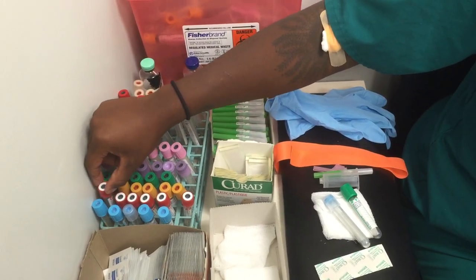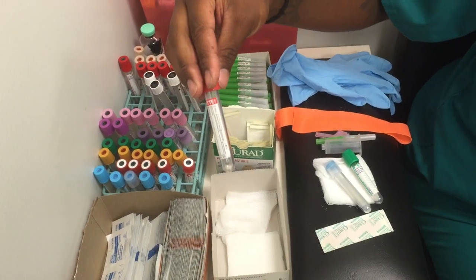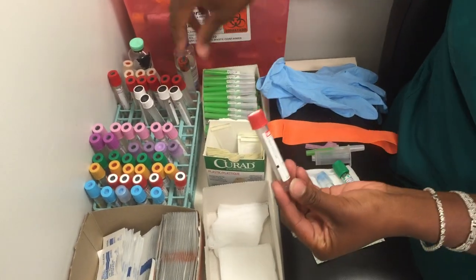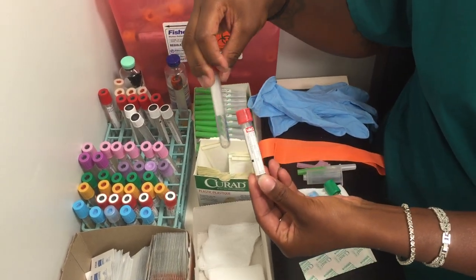Next, we have a red top tube. Now there are two types of red top tubes — we have glass ones and we also have plastic ones. The glass ones have no additives and the plastic ones have clot activators or nothing in them.